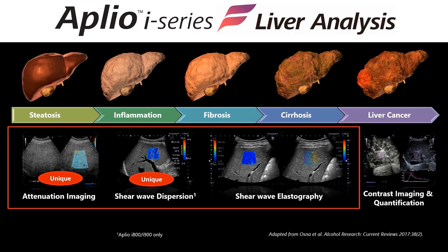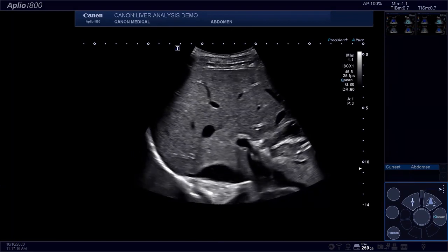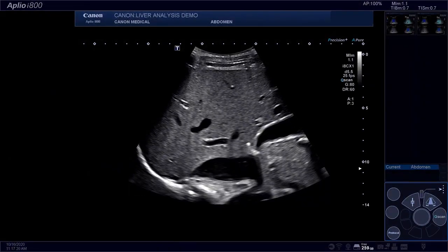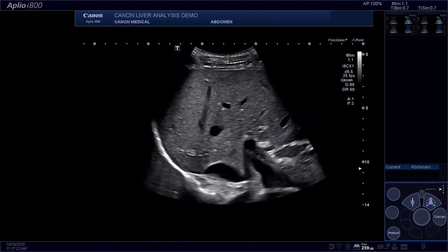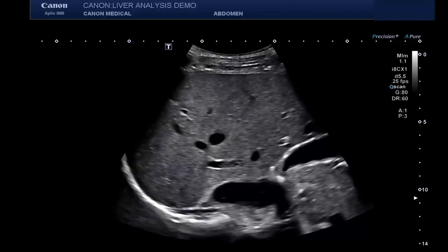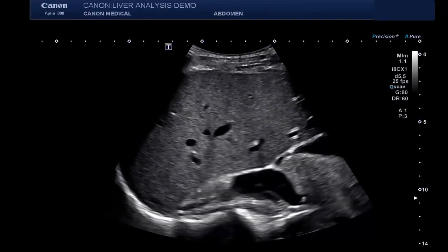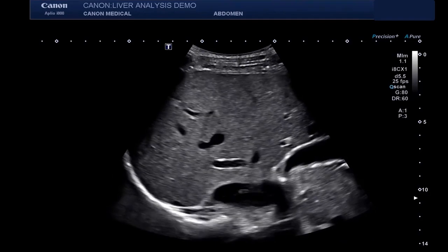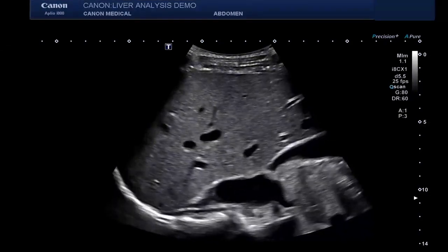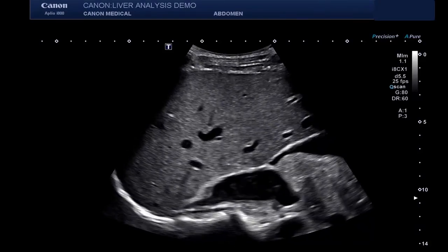Let's move to the Aplio i800 system and look at some live scanning. While scanning today, Tammy will be using an ultra-wideband matrix array transducer, the i8-CX1. This transducer utilizes Canon's intelligent Dynamic Microslice, or IDMS matrix technology, to control the firing of individual transducer elements in the lens direction, which creates a thin sliced beam giving great detail from skin line to the far field.